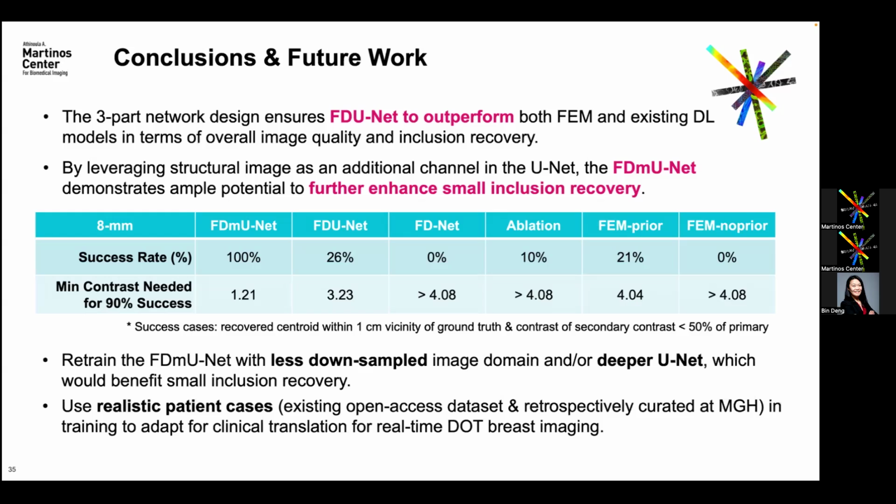Go ahead. When you're adding the DBT as an extra channel to the reconstruction, is the lesion marked on the DBT, or is it just the DBT? Great question. Right now it's very simple geometry. When we deploy the model, the DBT image will be just by itself with no need to mark. So that saves a lot of time, right? When it's radiologist marking, it's time consuming, back and forth.